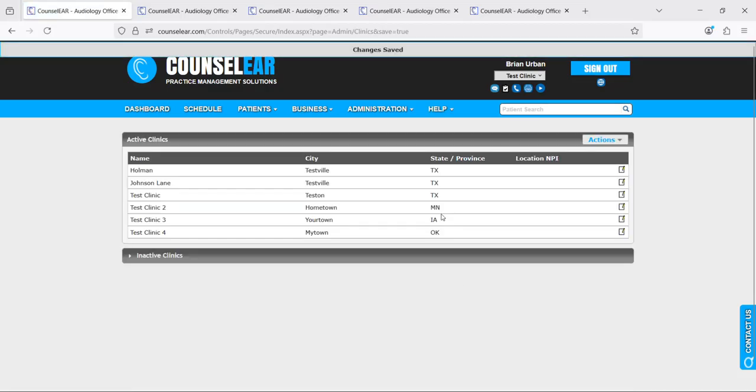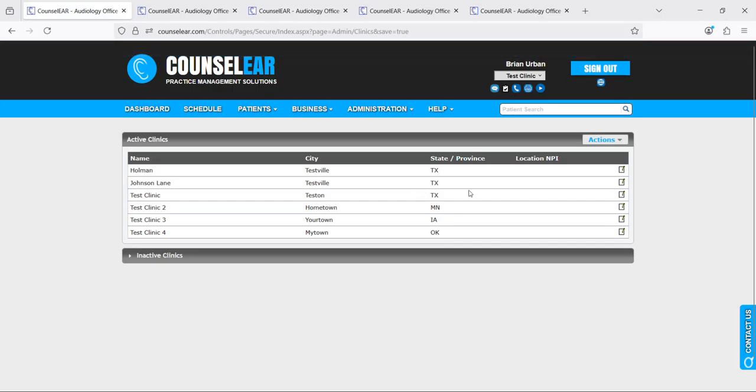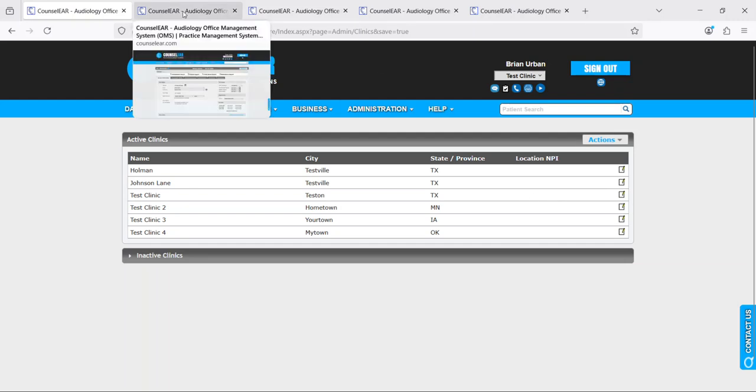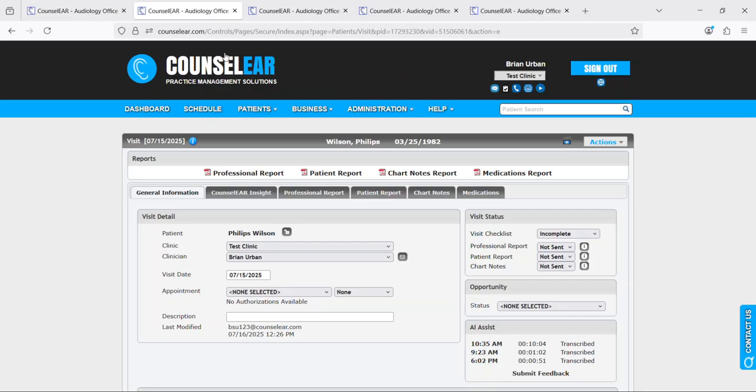If you wish to activate AI Assist for multiple clinics, of course just go through that same process for each additional clinic. Once you have activated for a specific clinic, then you will be able to use the Counselor AI Assist feature in a patient visit with a patient or the family as needed.